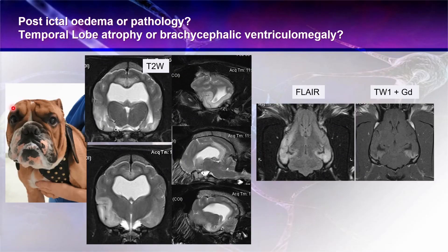The plot thickens with this dog. He's a bulldog, and typically bulldogs have big ventricles — and certainly these are big ventricles. Any brachycephalic breed is predisposed to having big ventricles. He also has quite thin temporal lobes, especially in the hippocampal area. These are the areas which are edematous, and we can see that coming through in the parasagittal region and right through to the cingulate gyrus and through the temporal lobe. Those are the FLAIR images, and these are also taking up contrast.